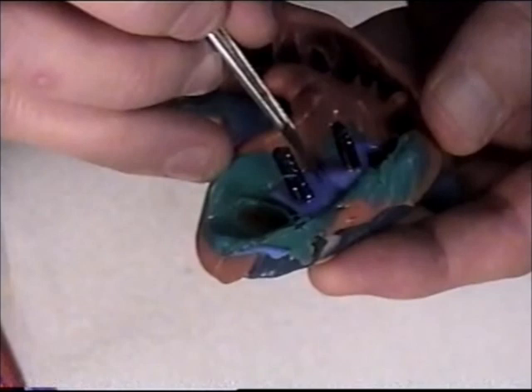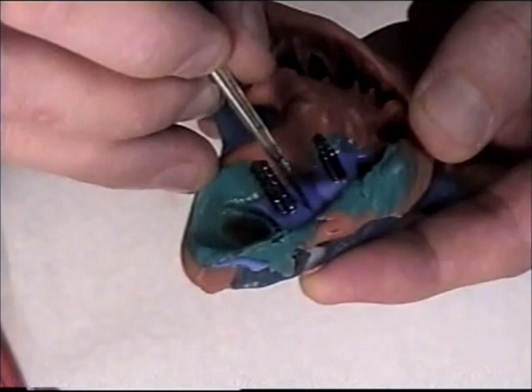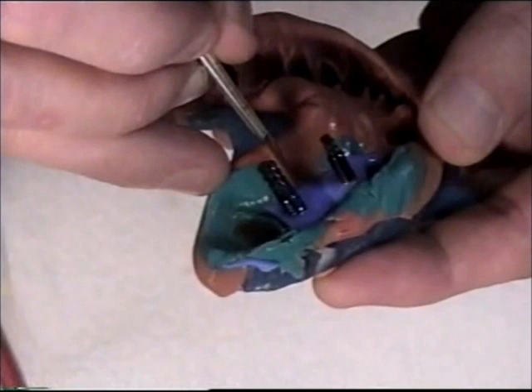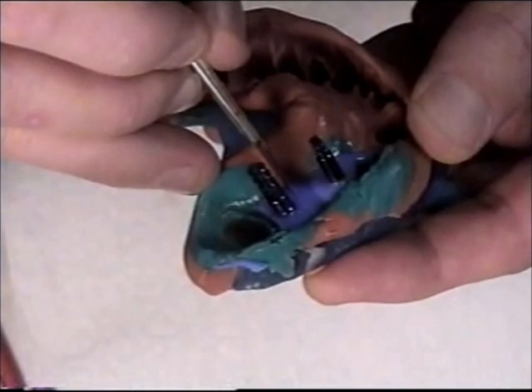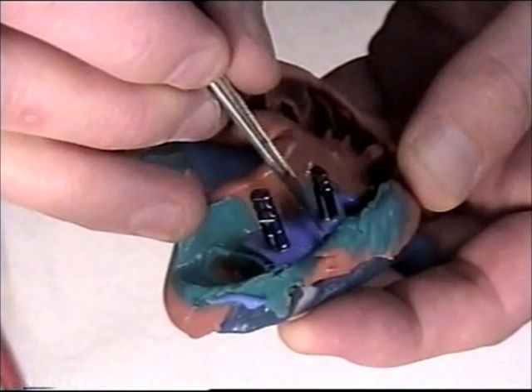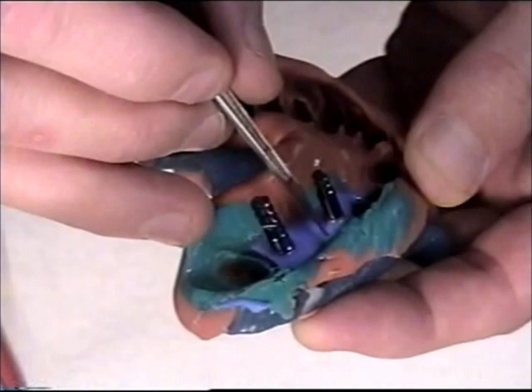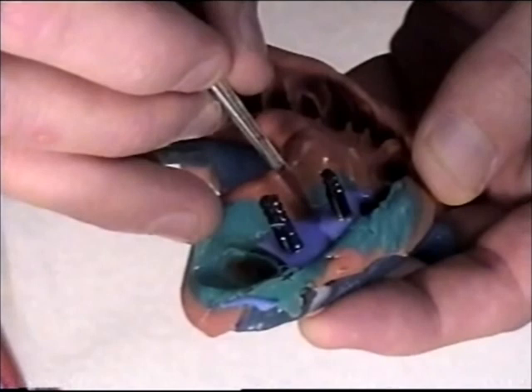And I'm going to make another cut right here. On the 3.4, I'm going to make a cut here. I actually could have let this set up a little harder. It's not as rigid as I really would like.